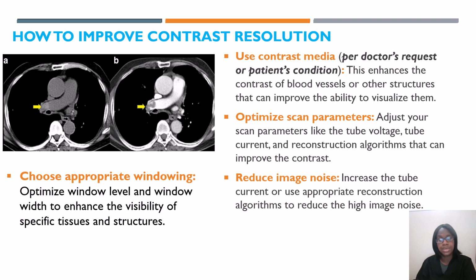Sometimes I do have to go up on the mA just a little bit to get a better image of where I'm at in the patient's abdomen or chest with my ROI. So whenever you are changing the parameters like this, if you are going out of range for the patient's body that you are scanning, it will probably make you put in a note of why you're increasing, let's say, the kVp or the mA.